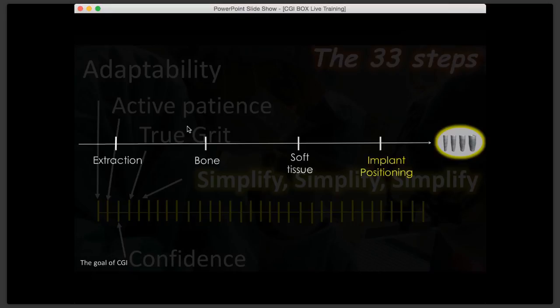But anytime the patient has biting, spontaneous pain, I can't help but think about a fracture. What's going to fracture? The weakest link. But we didn't do anything. Everything looked clinically fine. A couple of months later, the patient still had pain. So she came in, and this time I probably took a better radiograph, more orthoradial. Now you see bone loss in the furcation.